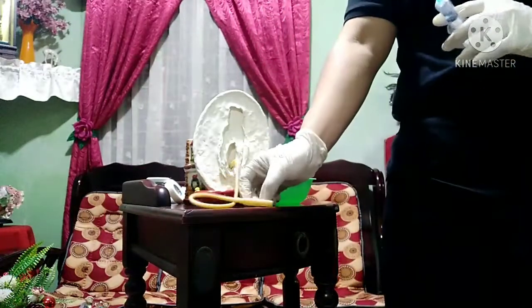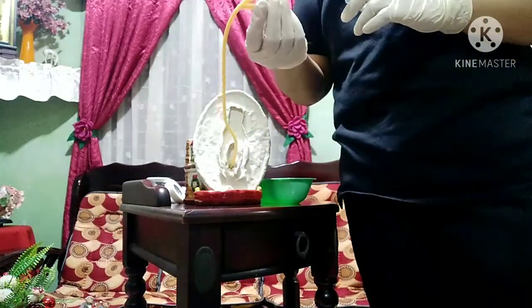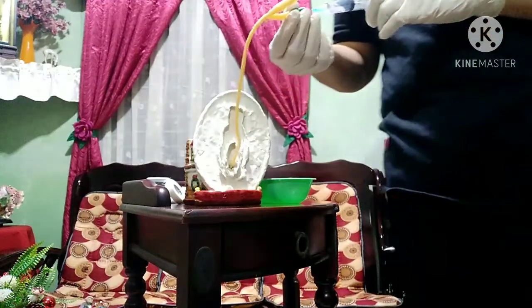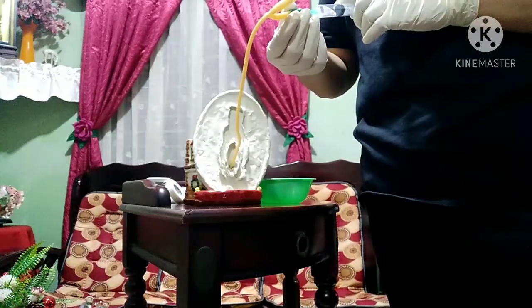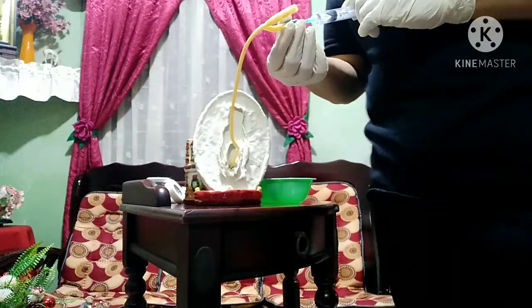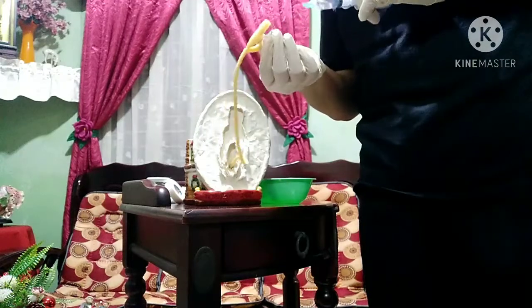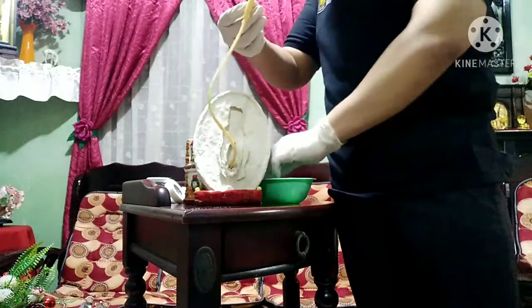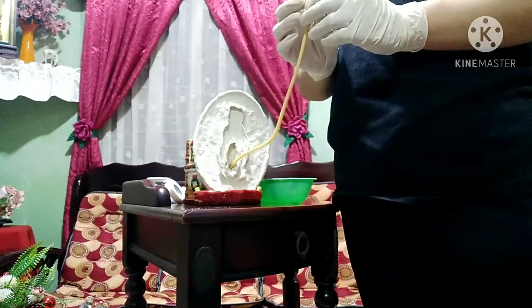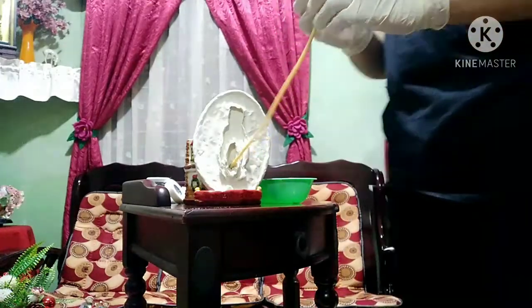So, ito po. So, i-inflate na po natin using sterile water po. Ayan. So, ayun po. And then step 19, pulls the catheter gently after to feel the resistance po.